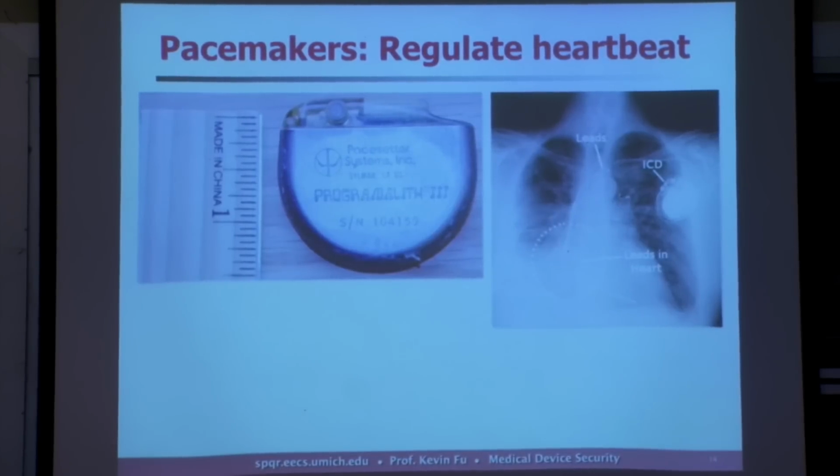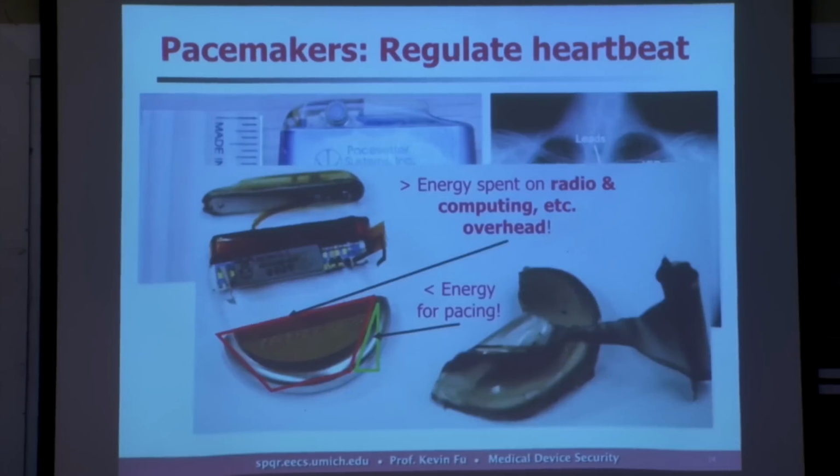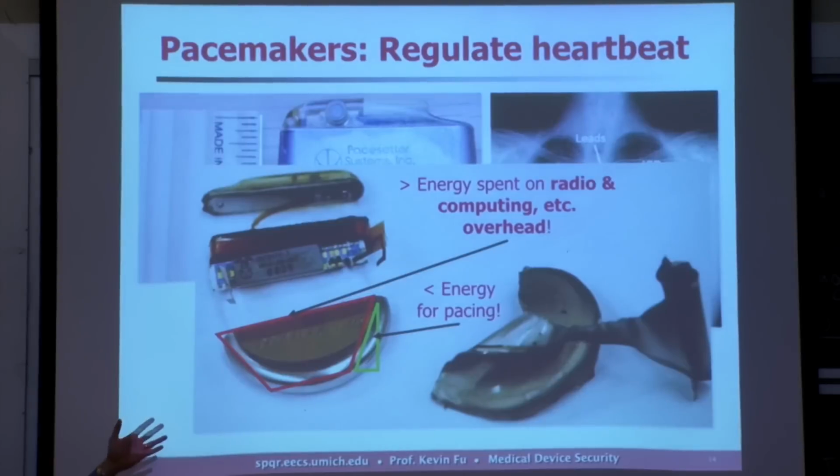So if you were to open up one of those devices, what you would find inside are vast resource constraints. If you want a hard engineering problem, pop open one of these devices. About half of the device is just a battery, a very high quality battery. These cost about $40,000 a pop on the market. Silver vanadium oxide, and you've got a little microcontroller at the top. Typically you have some antennas where you can do your communication for your control of the device as well. This is all hermetically sealed, implanted in your body.